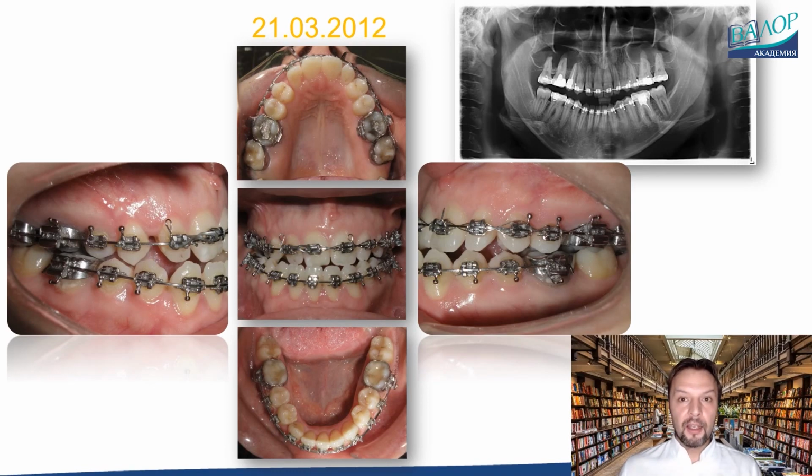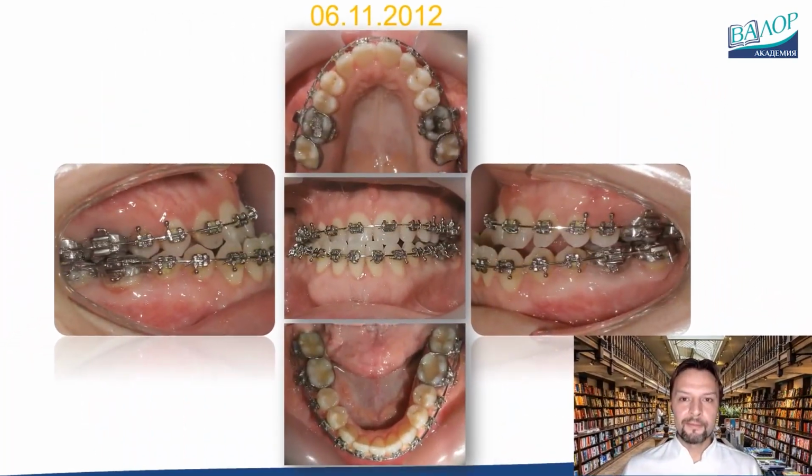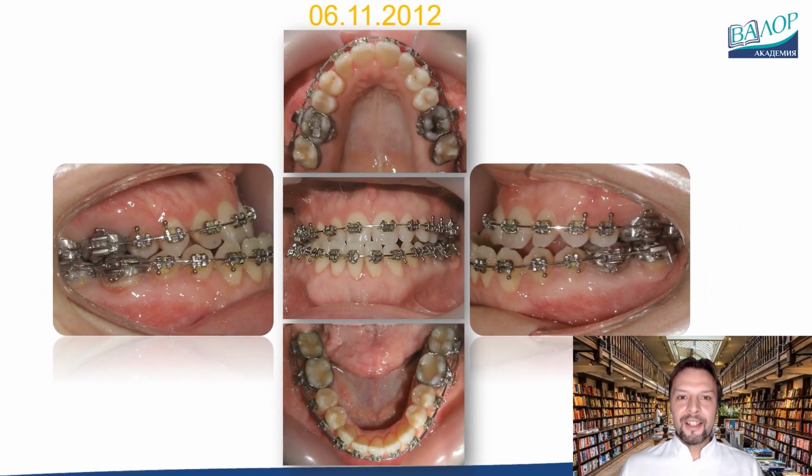That will ease fixation, immobilization, and will improve the prognosis after operation. OPG is needed to check the parallelism of the roots. Half a year later the second lower molars have been leveled and fit the models of the maxilla. The inclination of the incisors is normal.